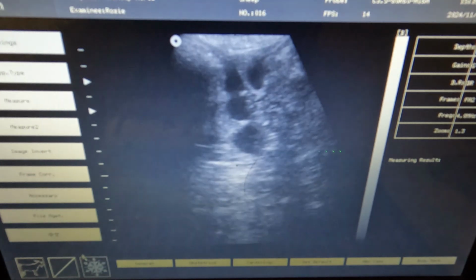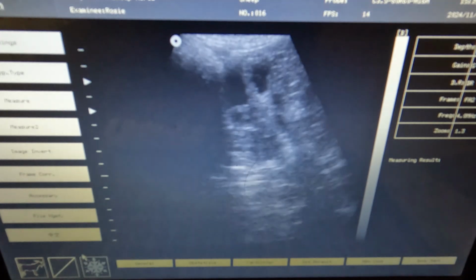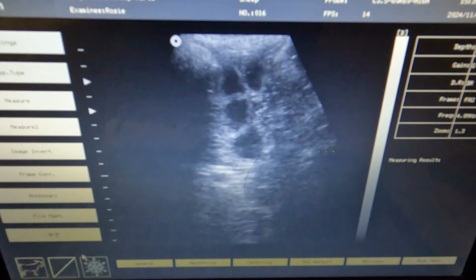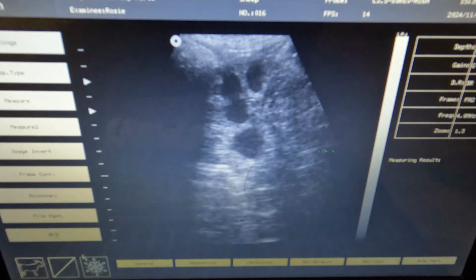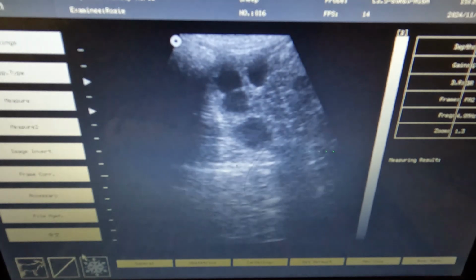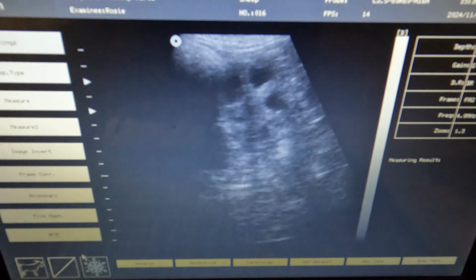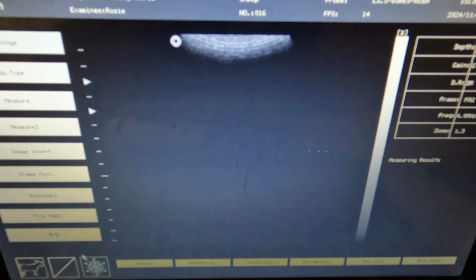I don't know. 35 days, I think, is pretty close. I don't know, those of you that do ultrasounds, maybe not quite that far. Like I said, I only saw Caffeine chasing her, so I don't know specifically that that was the day she was bred. But that definitely looks like 4, possibly 5 over there on the right side. I guess we'll definitely check her again next week.